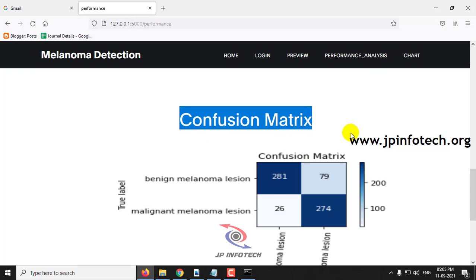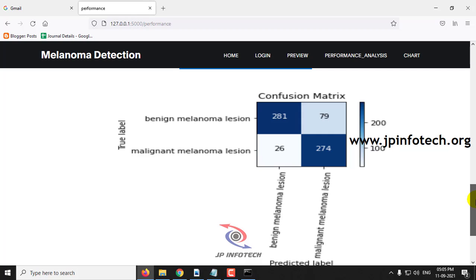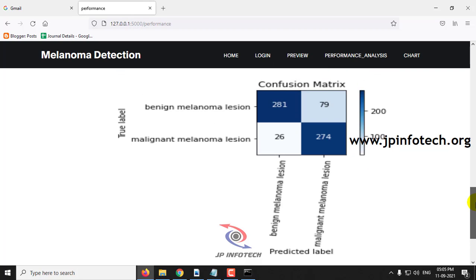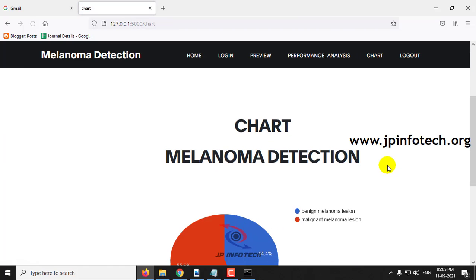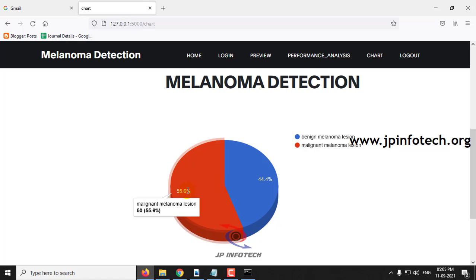Here you can see the confusion matrix. At last, let me go to the chart part, where you can see the percentage of the dataset available for Benign and Malignant, which consists of around 44% Benign and 55.6% Malignant.